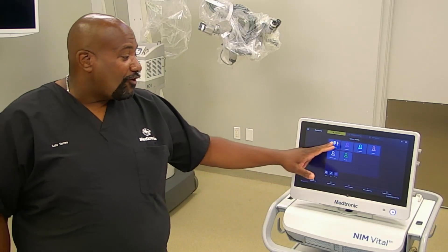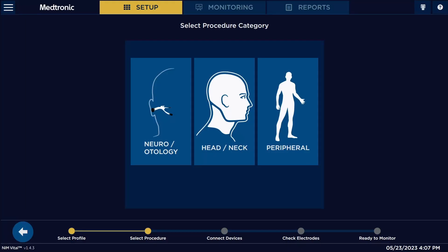You're going to pick default procedure. Here you have different procedures that you can pick. Again, we're doing parotid, so we're going to be clicking head and neck.